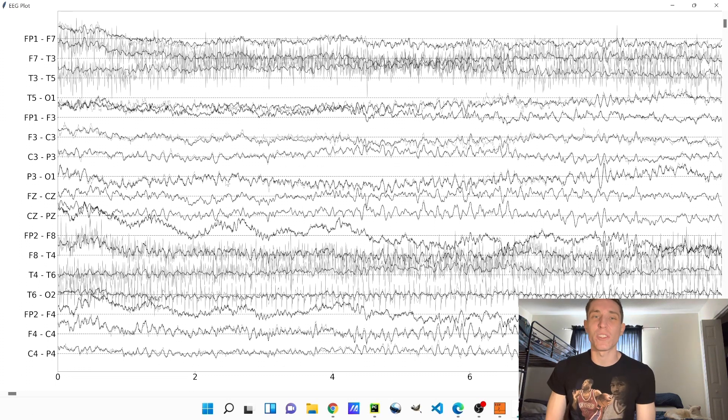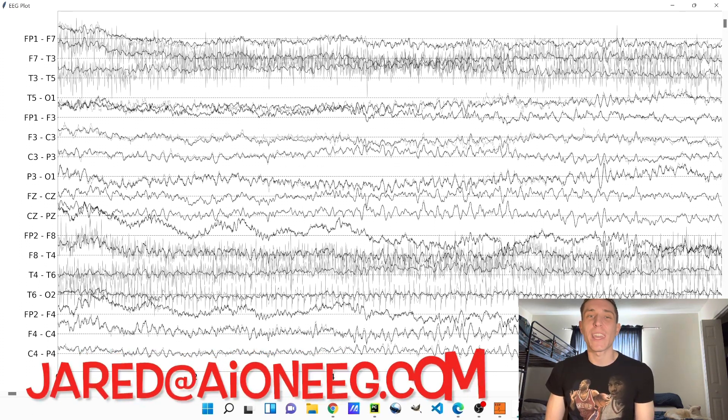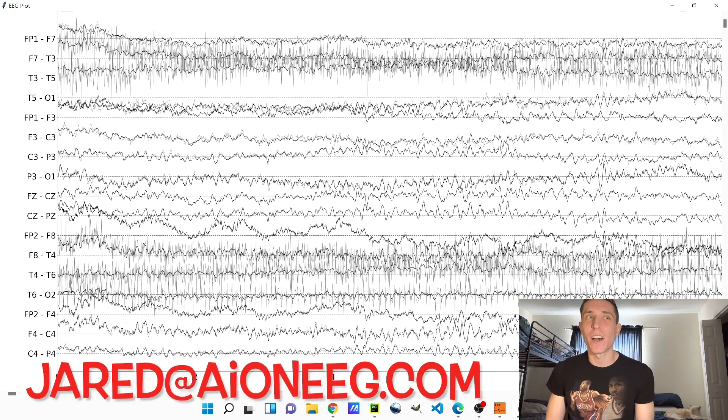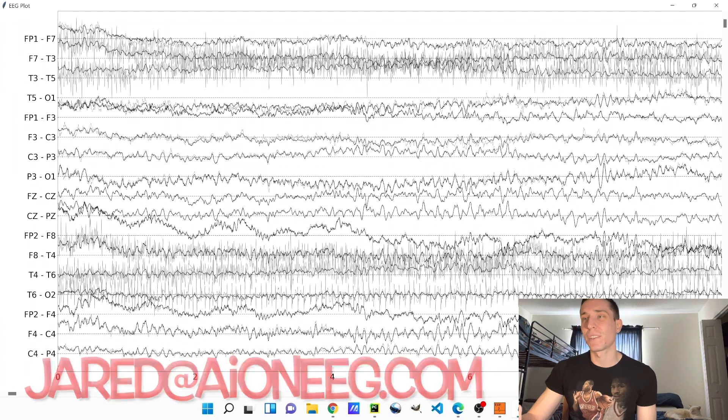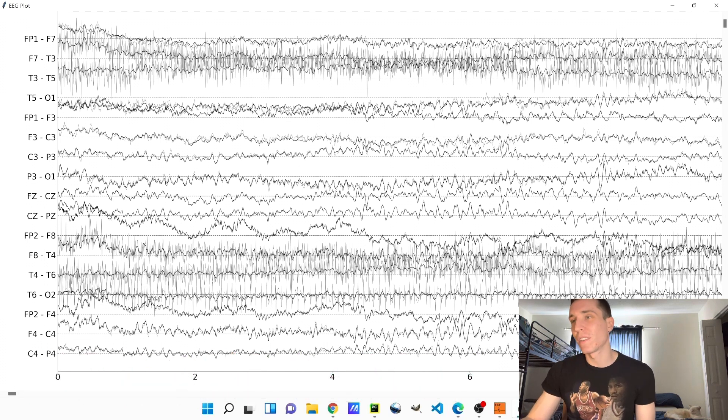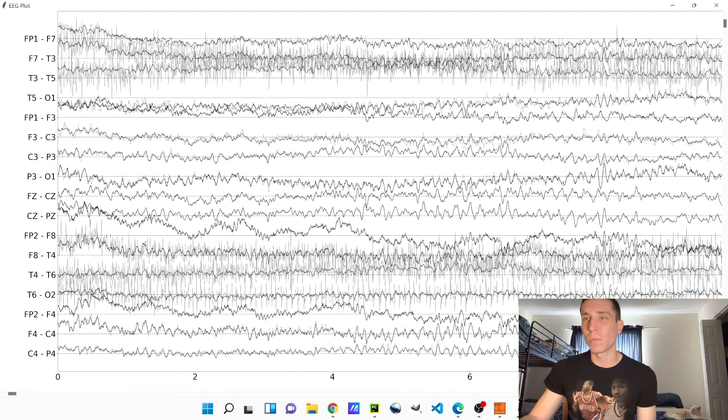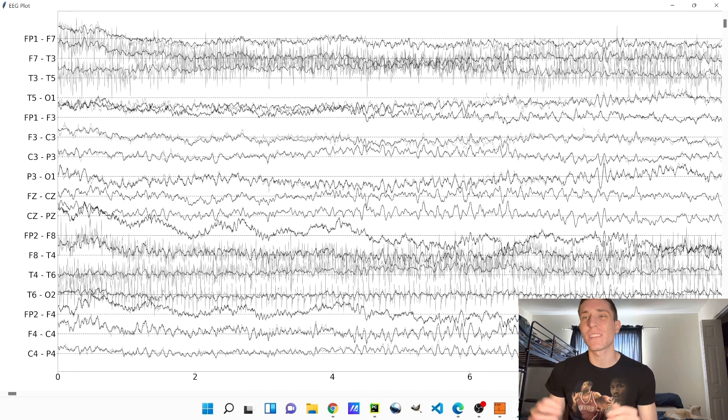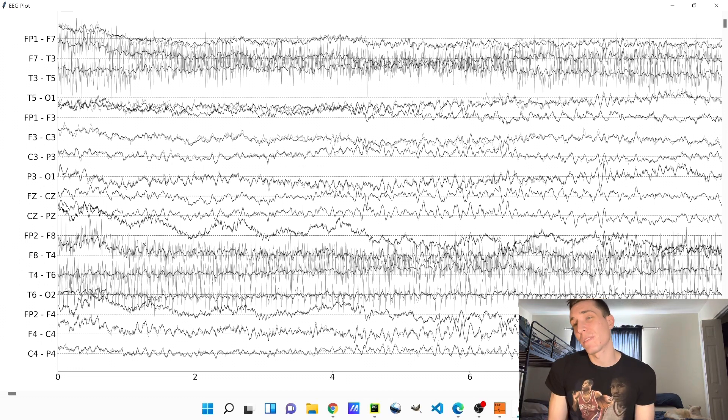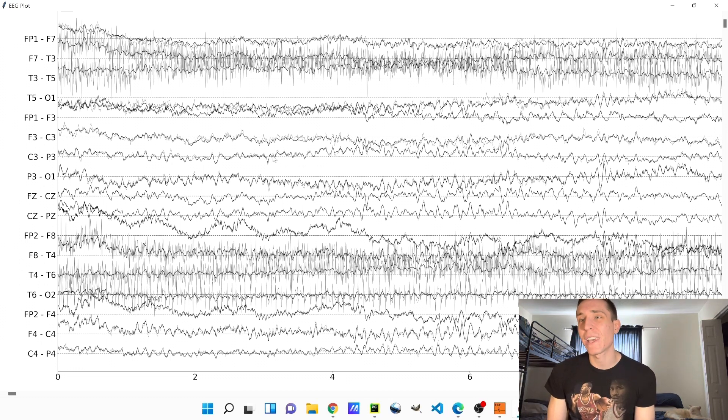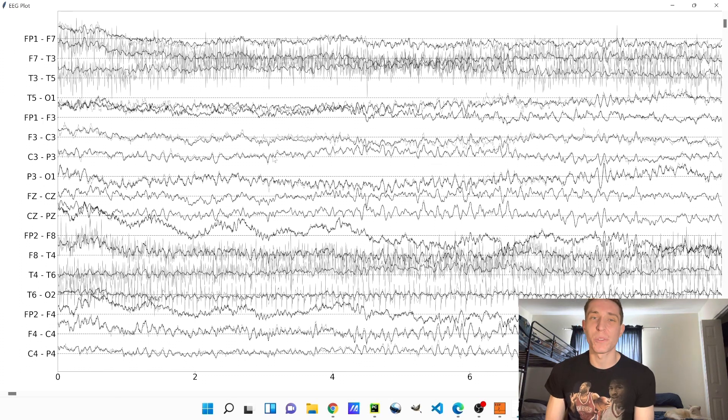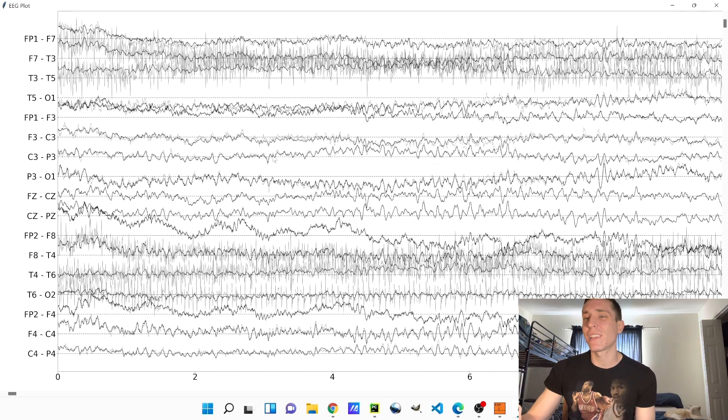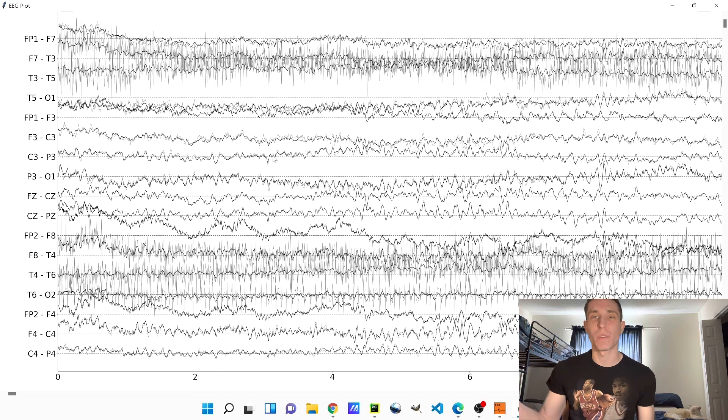So just email me at jared at aion eeg.com, that's how you spell it. So this is our AION artifact removal filter, we're just in the testing stages, we're looking for feedback. I want people to send me examples of EEG so I can test it on it and I'll send you back the EEG with the muscle artifact removed.